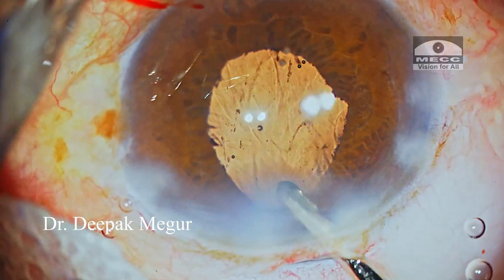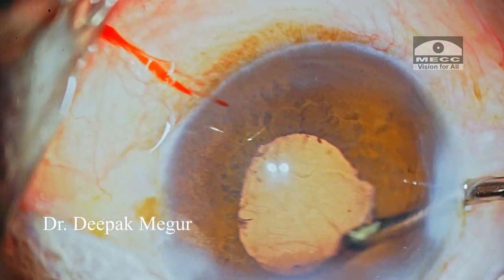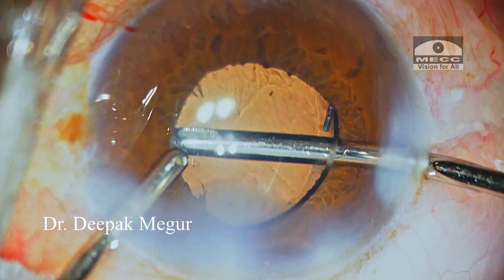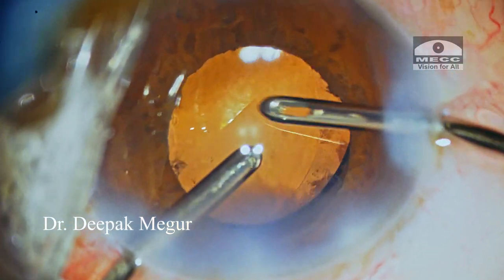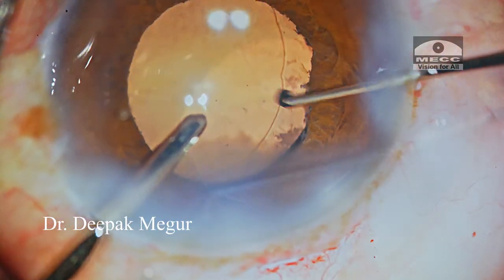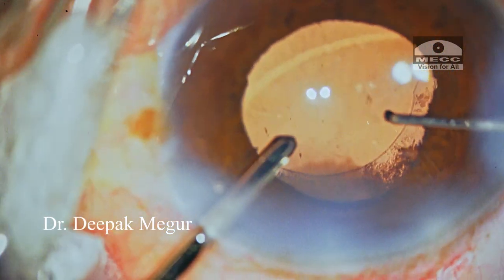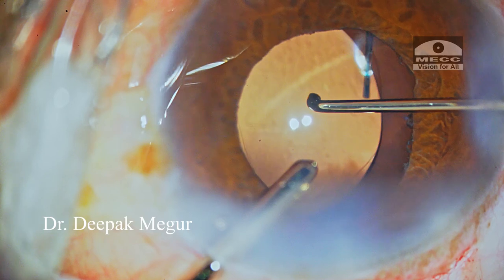Now is the time to remove the viscoelastic behind the lens. With bimanual I&A, I go behind the lens and remove all OVD behind it and also all OVD in front of it. Now is the time to perform the optic capture. My left hand has the irrigation handpiece, and using the Sinski hook in my right hand, the optic is gently tapped down so that it goes behind the capsulorhexis margin.